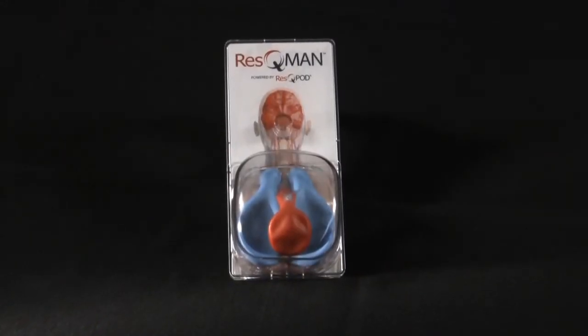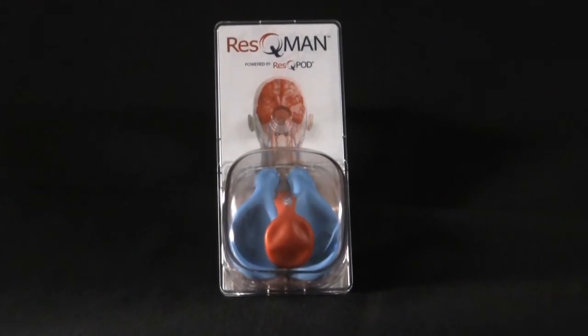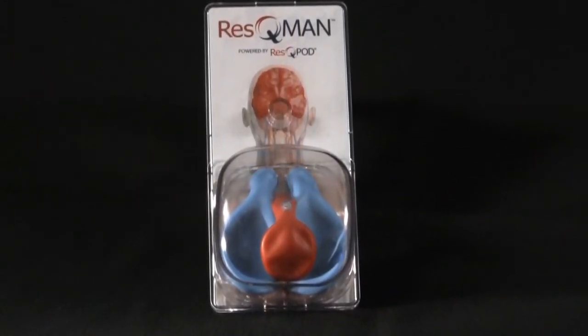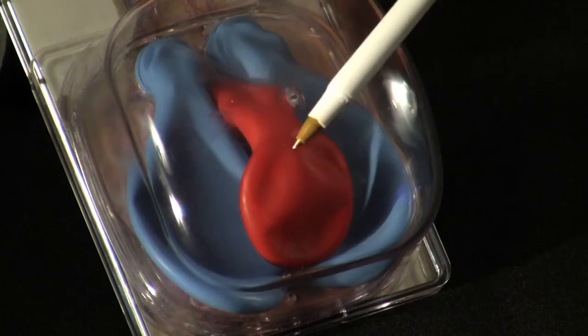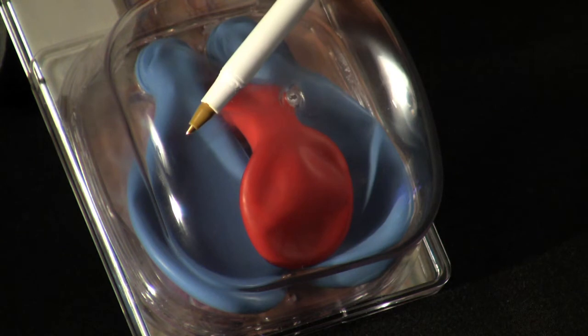To understand how rescue CPR works, we'll use our demonstrator and first talk about how conventional manual CPR circulates blood. Here the red balloon is the heart, and the blue balloons are the lungs.